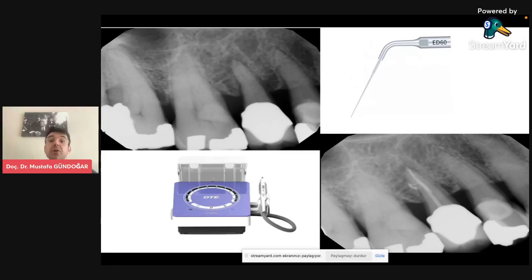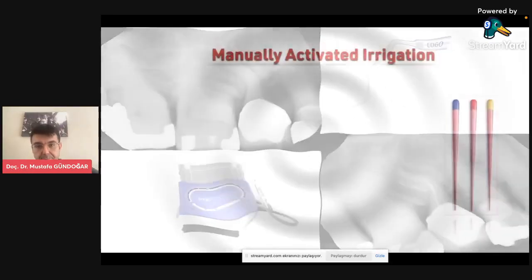It is really very important for you to activate your root canals. Please don't forget untouched areas after shaping your root canal, because using nickel-titanium instrumentation techniques will not provide a very clean root canal surface for you. For the disinfection of lateral canals, isthmuses, and all ramification areas, you should activate your irrigant very, very well.